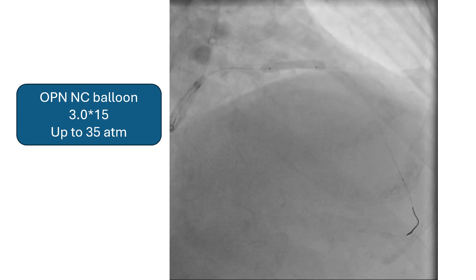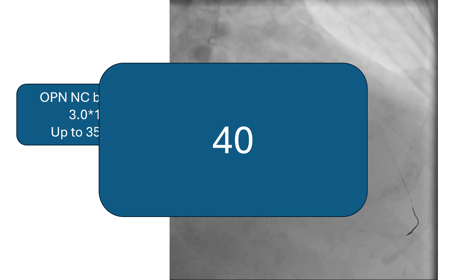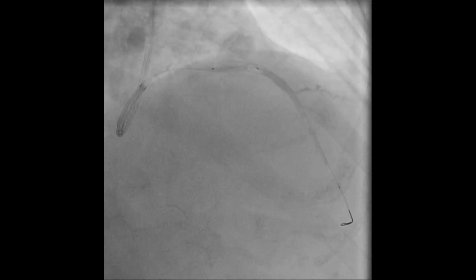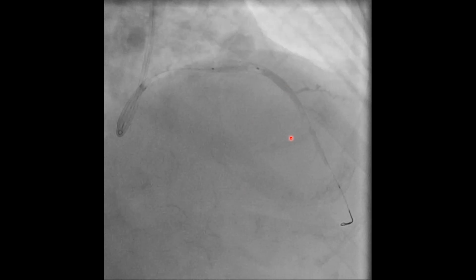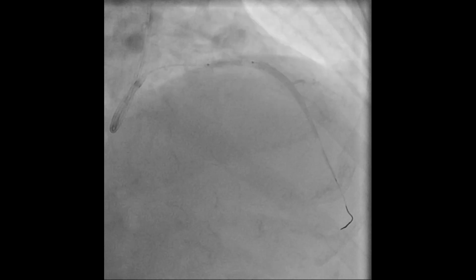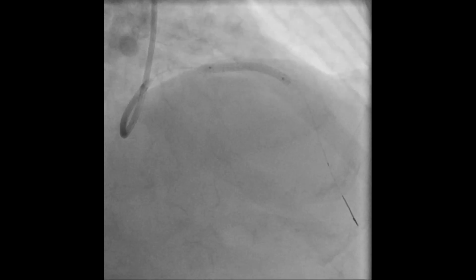We used a new OPN NC balloon 3 by 15, initially inflated up to 35 atmospheres. You have to increase the pressure by 5 atmospheres and wait for 5 seconds. So we inflated to 40, and then 45 — and this is what we got. The balloon ruptured and there was a type 3 perforation. As we had decided, we went right away for a stent graft and used it, without going through the full algorithm of how to manage perforation.